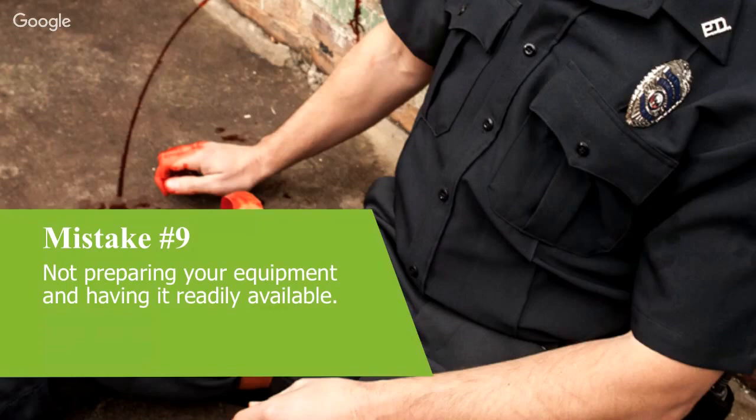Think about other things that you might need quickly as well, things like your nasopharyngeal airways, oral airways, decompression needles, the stuff that you need in those immediate massive hemorrhage control, airway, breathing type interventions. You don't want to be digging in the bottom of your pack for that kind of stuff. Quick clot, pressure dressings, that kind of stuff. You want it relatively accessible in external pouches of a kit, ideally in a pocket where you can get at it.